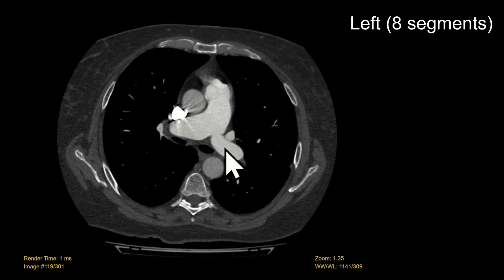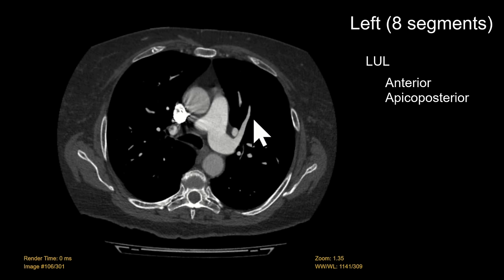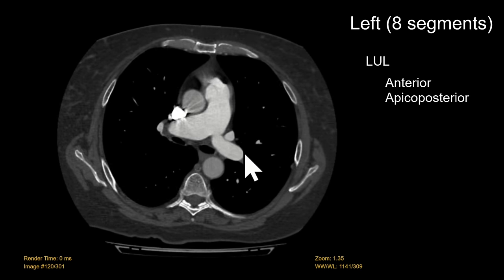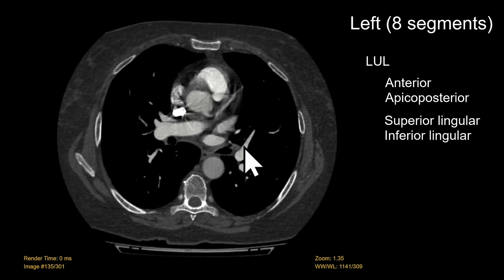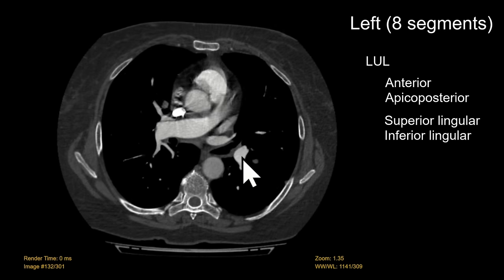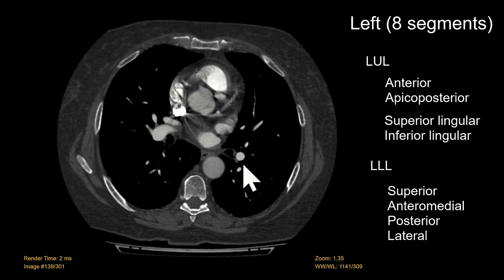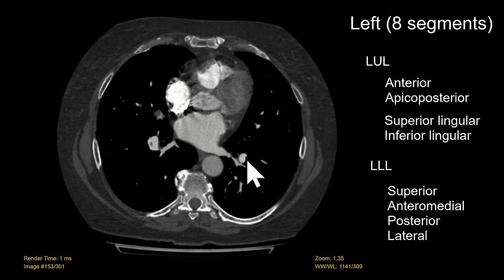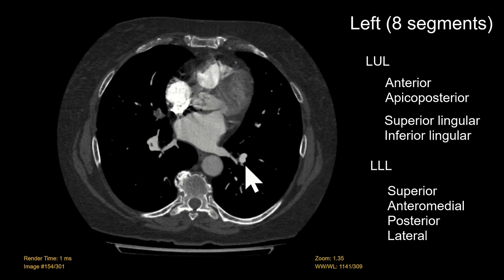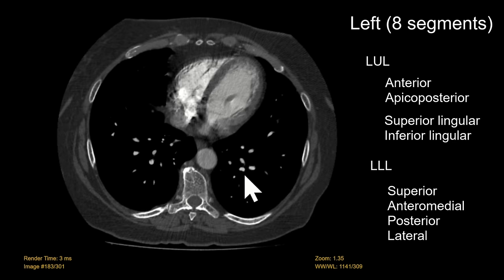On the left we have eight segments. The left upper lobe splits into the anterior segmental branch and the combined apical-posterior branch. Part of the upper lobe is the lingula with superior and inferior segmental branches. In the left lower lobe we have the superior segmental branch posteriorly and then three basal segments — the anterior-medial branch, and the posterior and lateral branches.